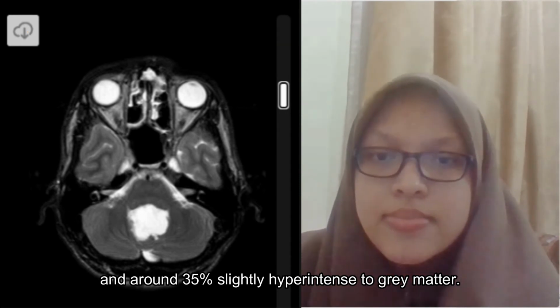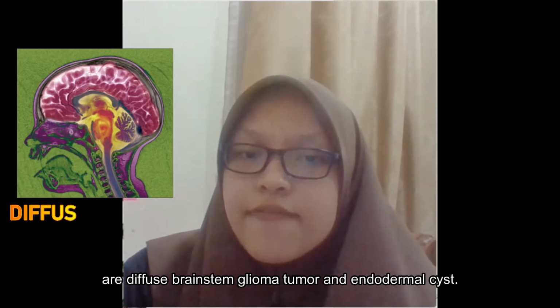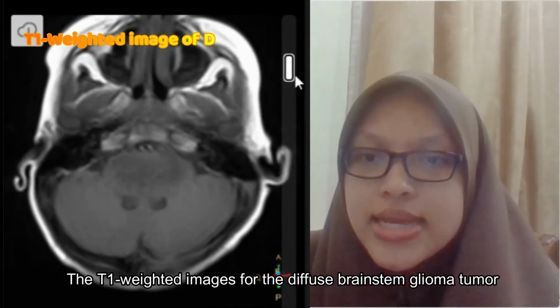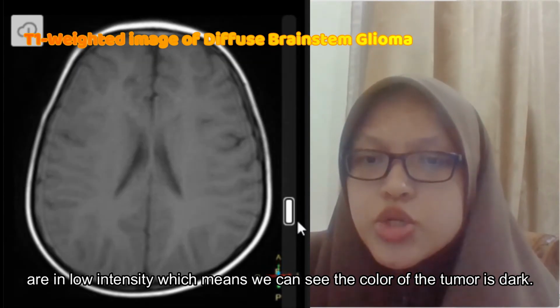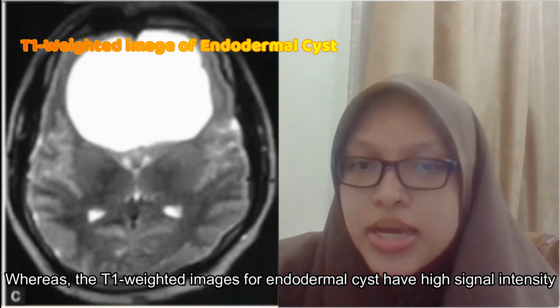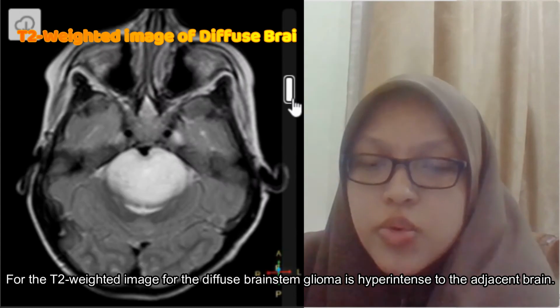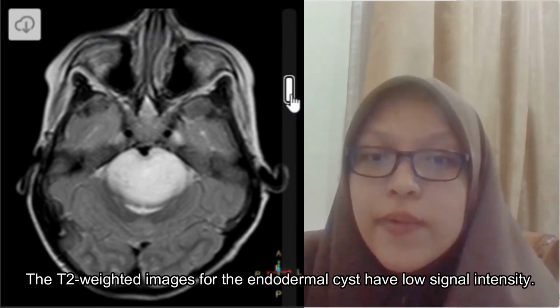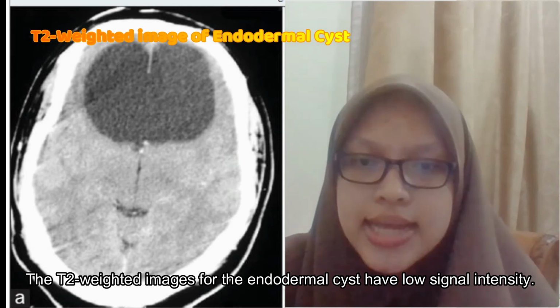And for the last brain tumor and cyst that we're going to distinguish, they are the diffuse brainstem glioma tumor and endodermal cyst. The T1-weighted image for the diffuse brainstem glioma tumor is low intensity, which means we can see the color of the tumor is dark. Whereas the T1-weighted image for the endodermal cyst has high signal intensity. The T2-weighted image for the diffuse brainstem glioma is hyperintense to the adjacent brain, while the T2-weighted image for the endodermal cyst has low signal intensity.